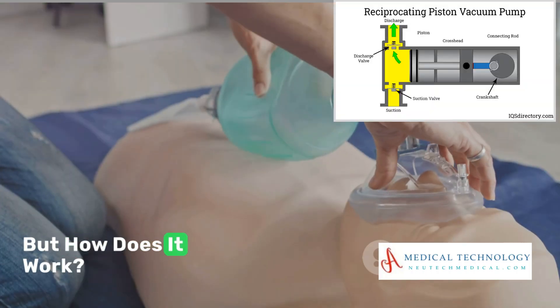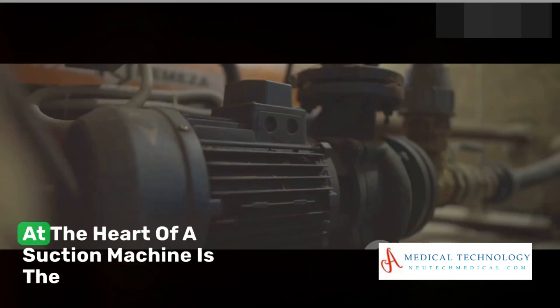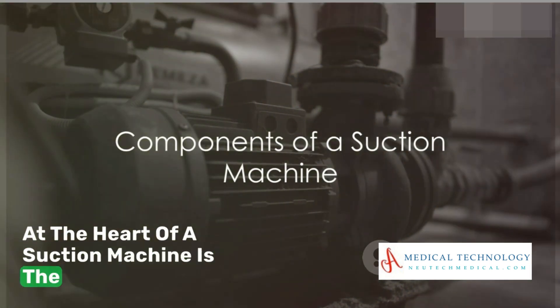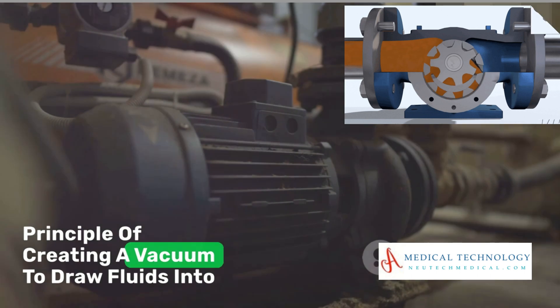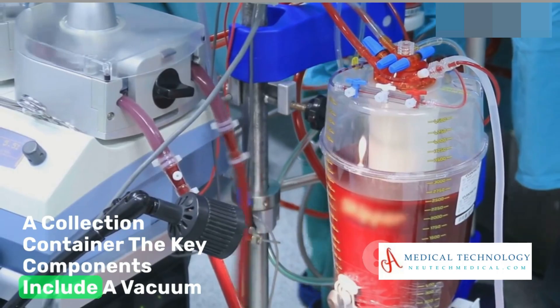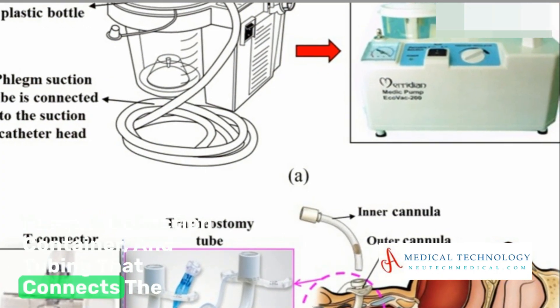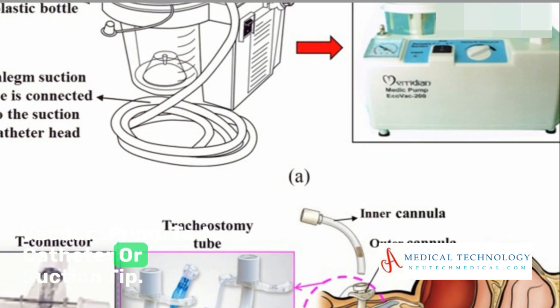But how does it work? Let's dive into the fascinating world of suction machines. At the heart of a suction machine is the principle of creating a vacuum to draw fluids into a collection container. The key components include a vacuum pump, a collection container, and tubing that connects the vacuum pump to a catheter or suction tip.